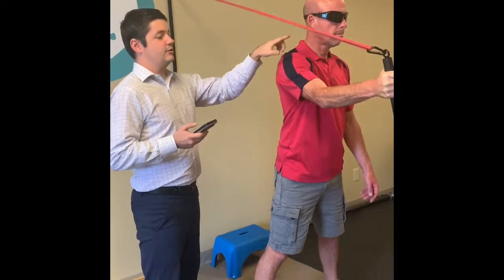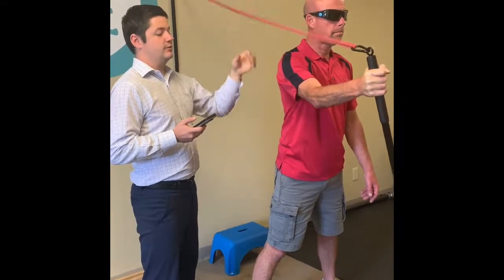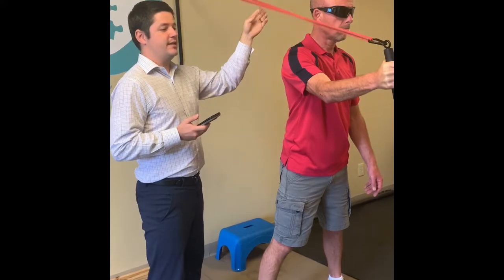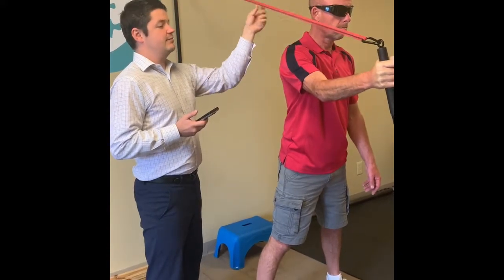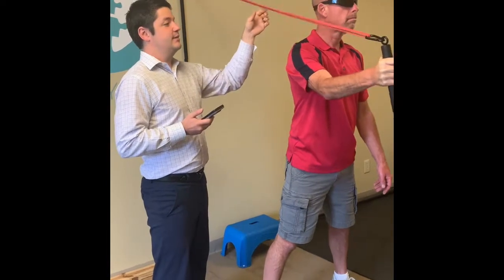So what we're doing with Mark now — he's got the strobe goggles on, working on stabilization of the shoulder. This is for basically lateral epicondylitis, sloppy hinge syndrome in the elbow. And then I'm giving him a little bit of a dynamic stability exercise by trying to hold that.